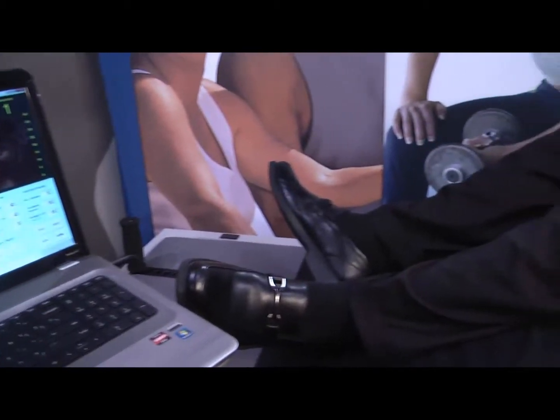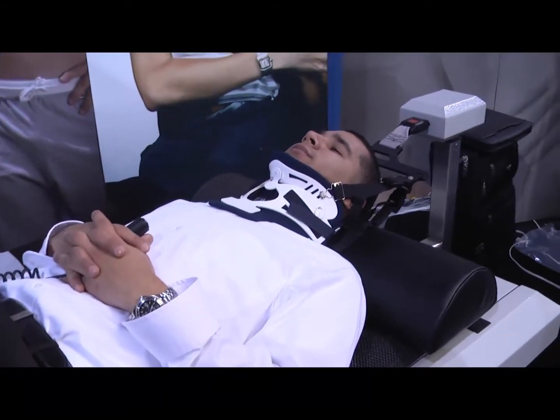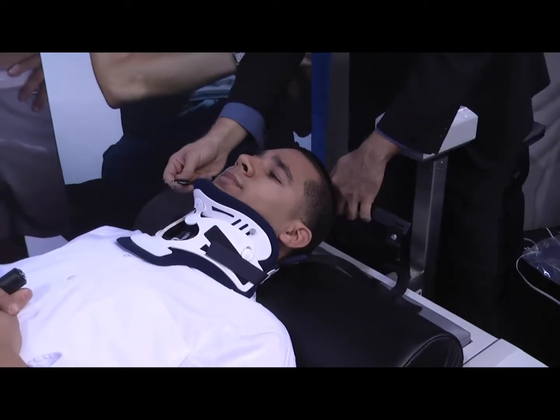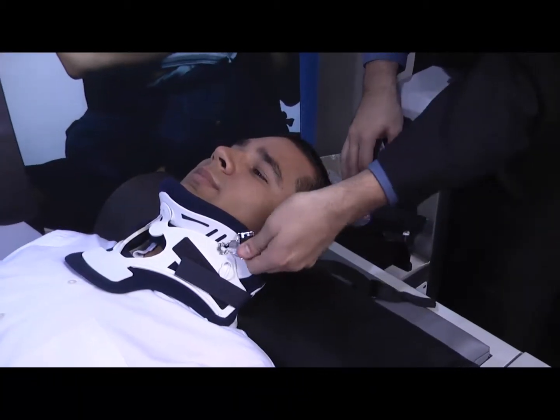For the cervical treatment, the patient's head is towards the end of the table. It can only be done supine. The patient will have a collar, which is attached also to the tensionometer, that will measure the pounds. Usually the maximum pounds will be around 24 pounds for cervical.